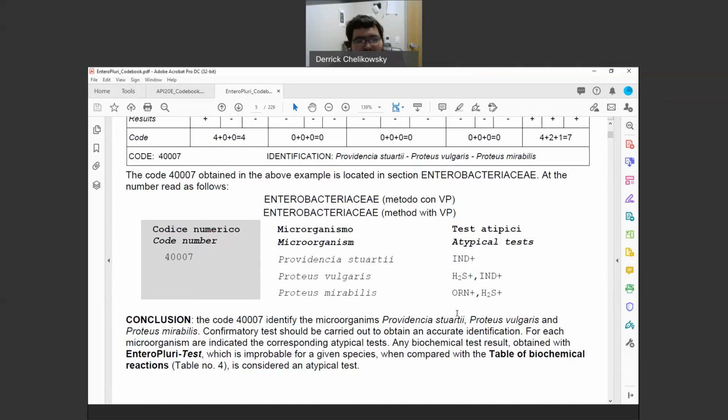Or as we get to our Shigella and how we would tease out that other bacteria. So once again, I'm going to annotate so we have our number here. Our number we're going to be looking up is 41100. That's our number. So keep that in mind as we go forward.